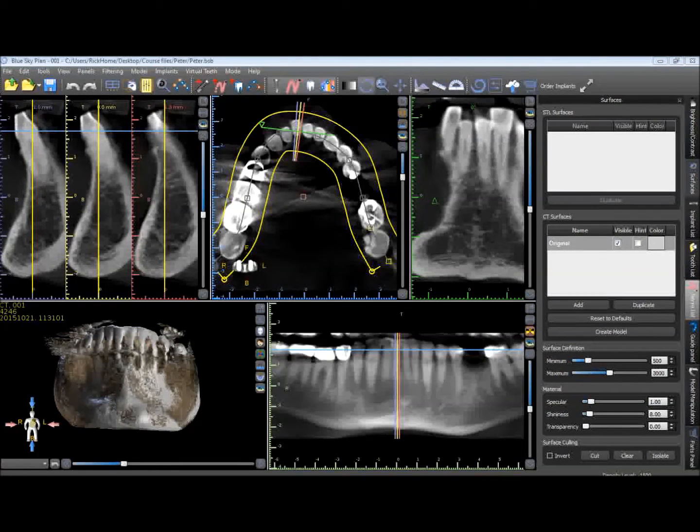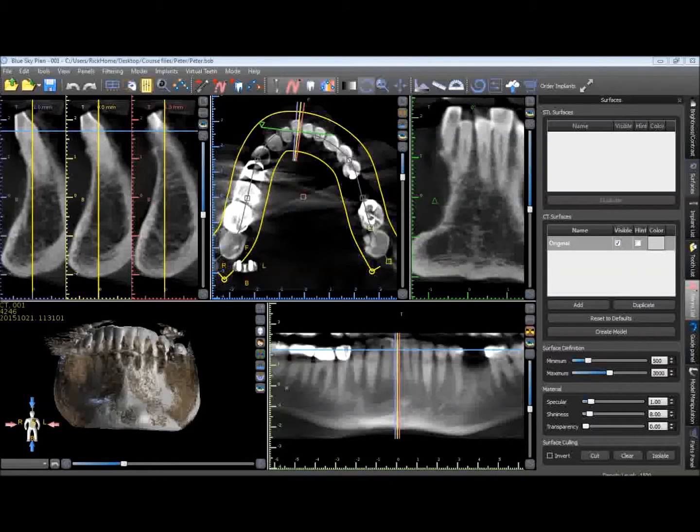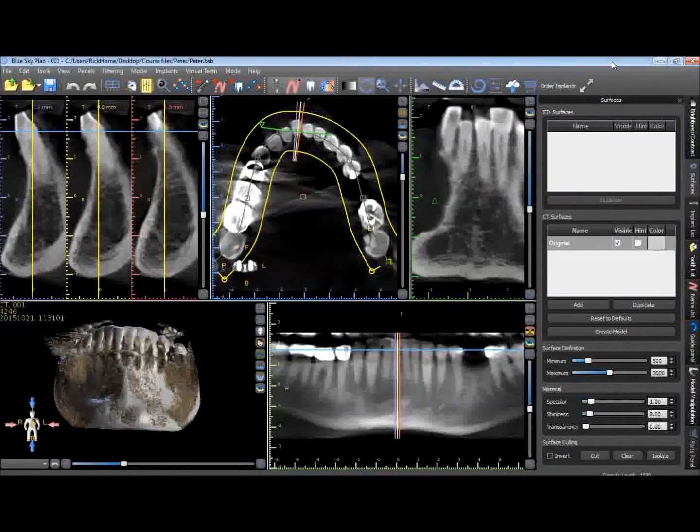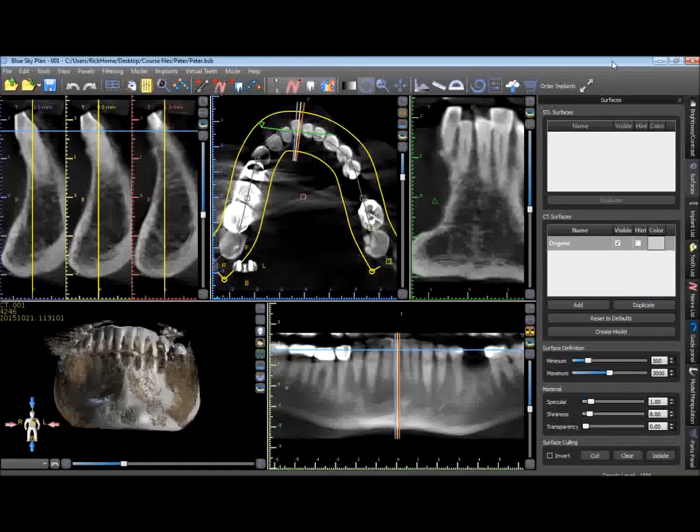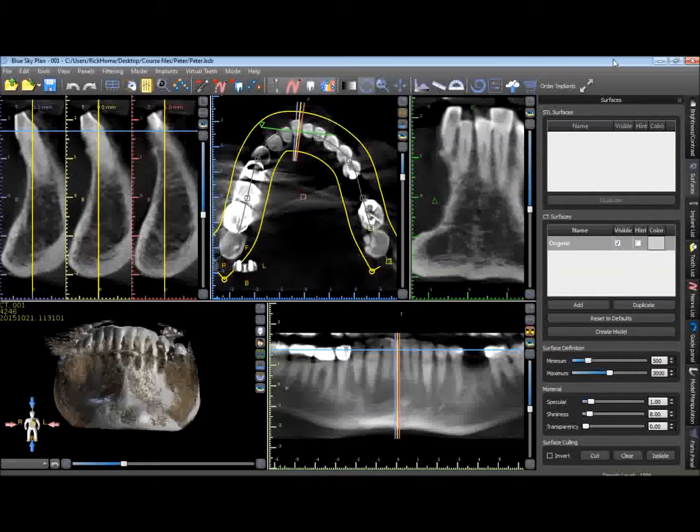Hello, this is Dr. Rick Ferguson. Today we'll be demonstrating the so-called digital pour technique of taking a VPS impression, placing it into a CBCT scanner, scanning that VPS impression, and creating a DICOM dataset from that impression.